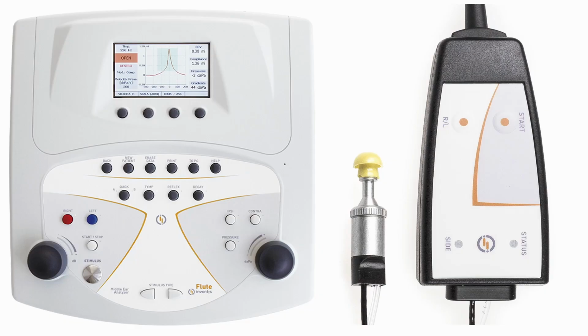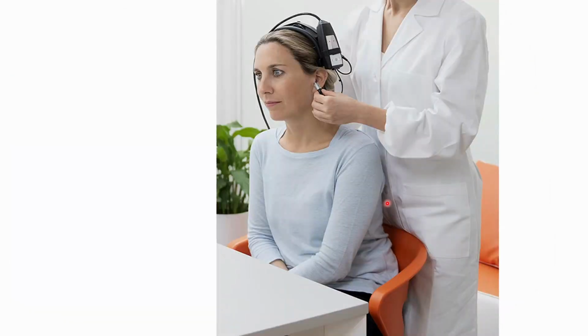So this is the machine in our hospital. This is a tympanometer. This is the probe which is placed inside, and on this you can push the button when the ear canal is sealed with the probe. So how to apply this? With a headband, you can apply this part to the head, and the other hand will be free, so you can place the probe inside and press the start button here.